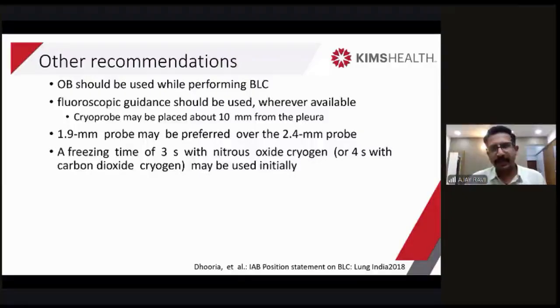And it is always recommended that you use an occlusion balloon. Fluoroscopic guidance is always recommended whenever it is available, and it is always recommended to use a 1.7 or a 1.9 probe, not the 2.4 probe.